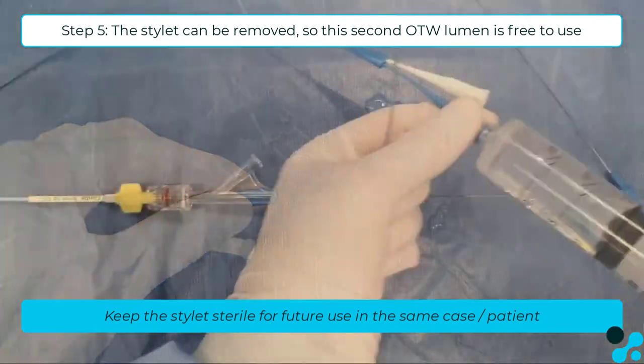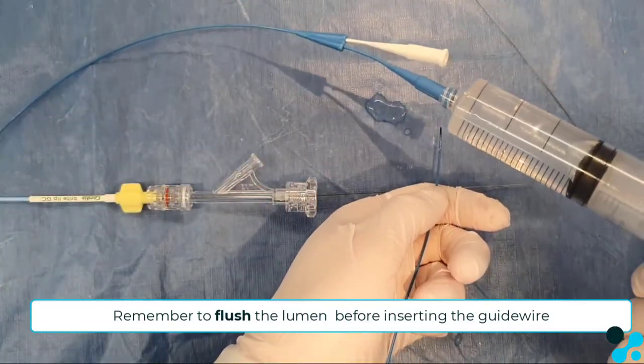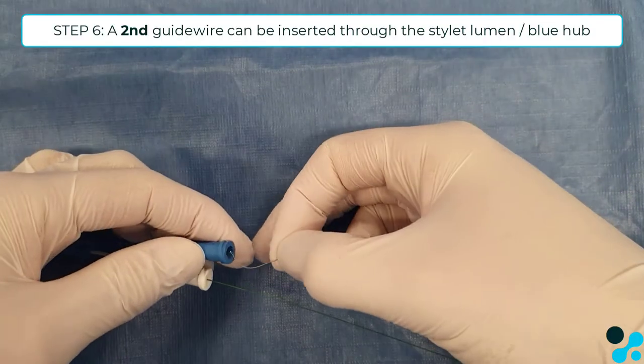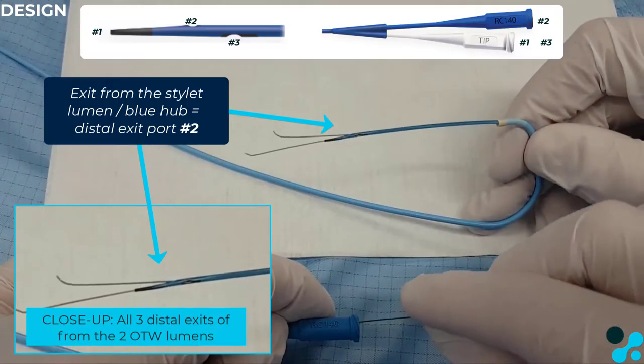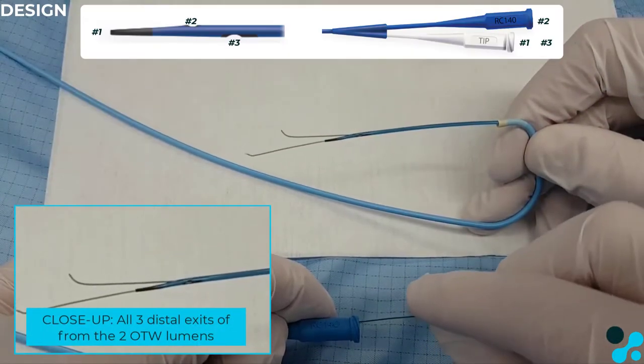When the stylet is inserted in the blue hub, there is no space for a guide wire. Take it out and flush the lumen in order to bring a second guide wire through the blue stylet lumen. That guide wire will come out of the middle exit port number 2, so 2 stands for blue.